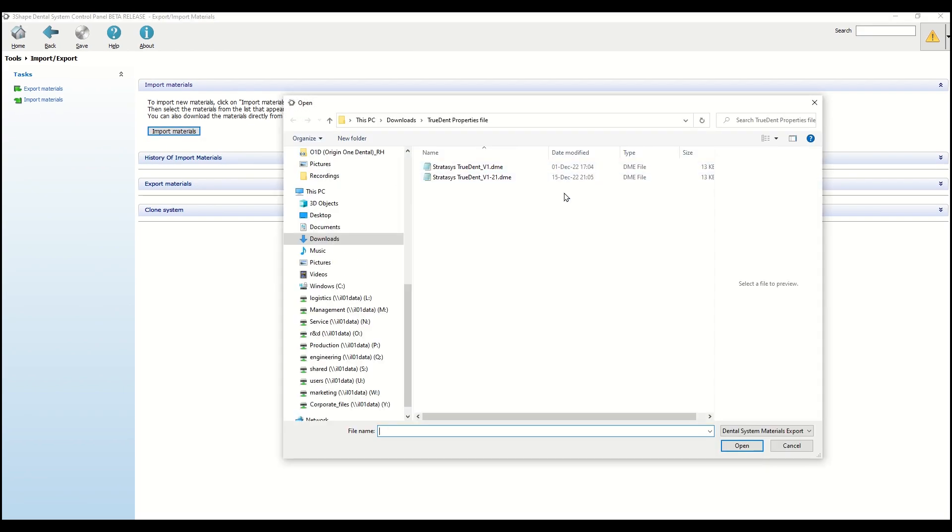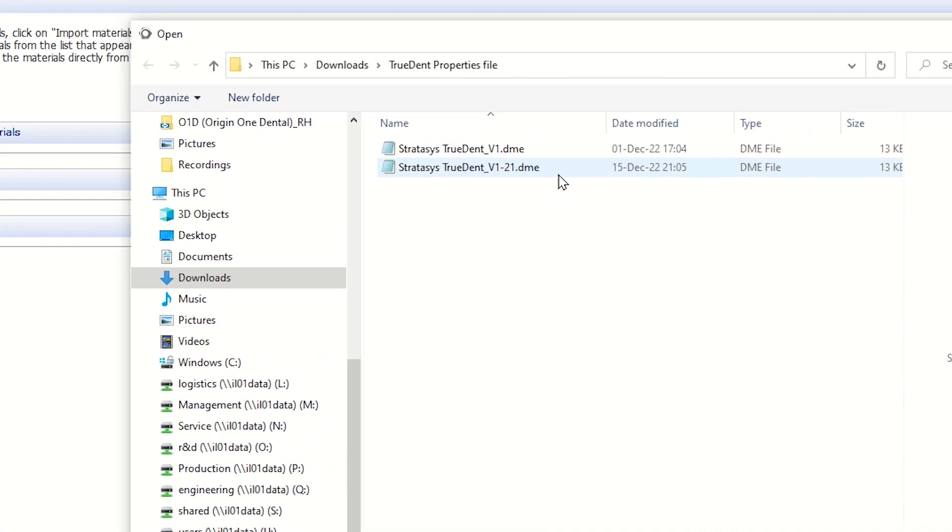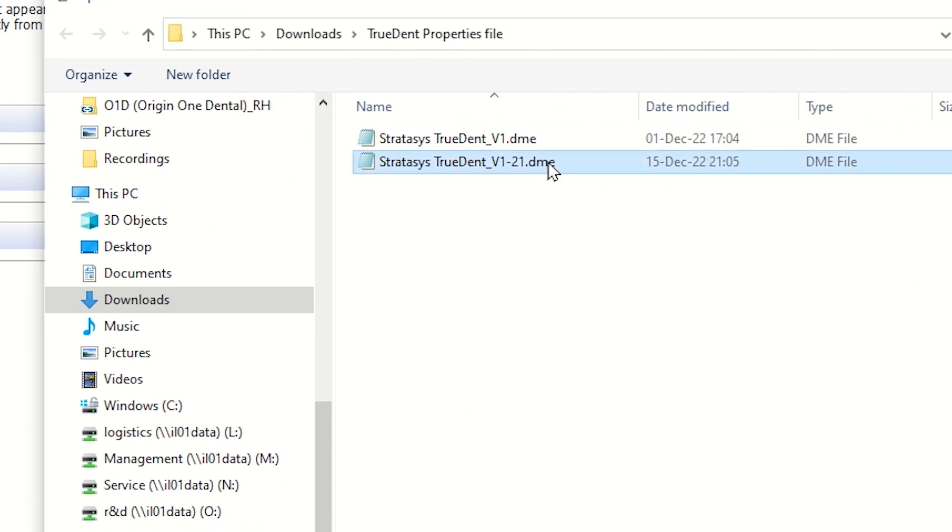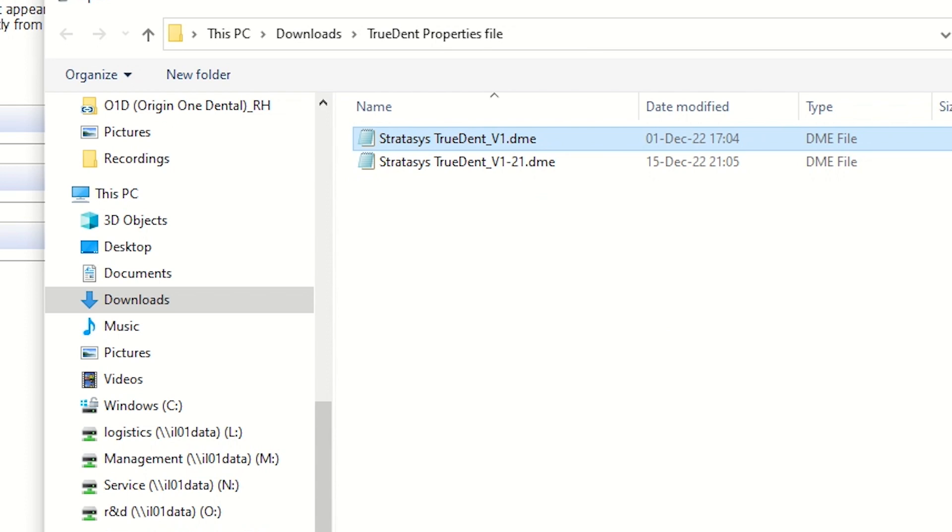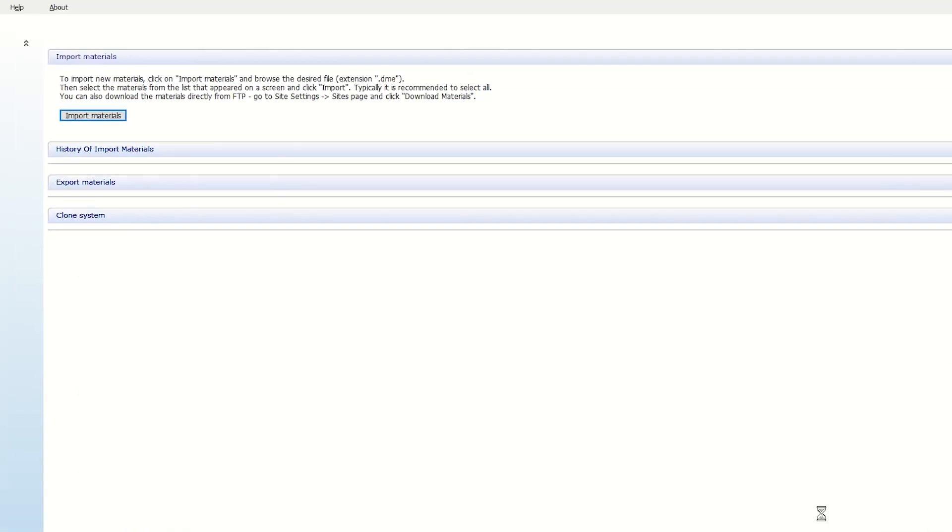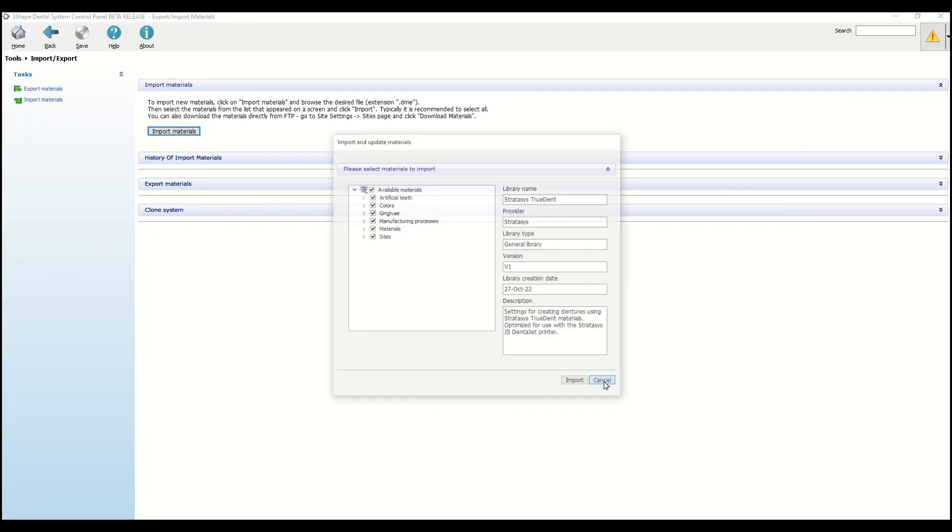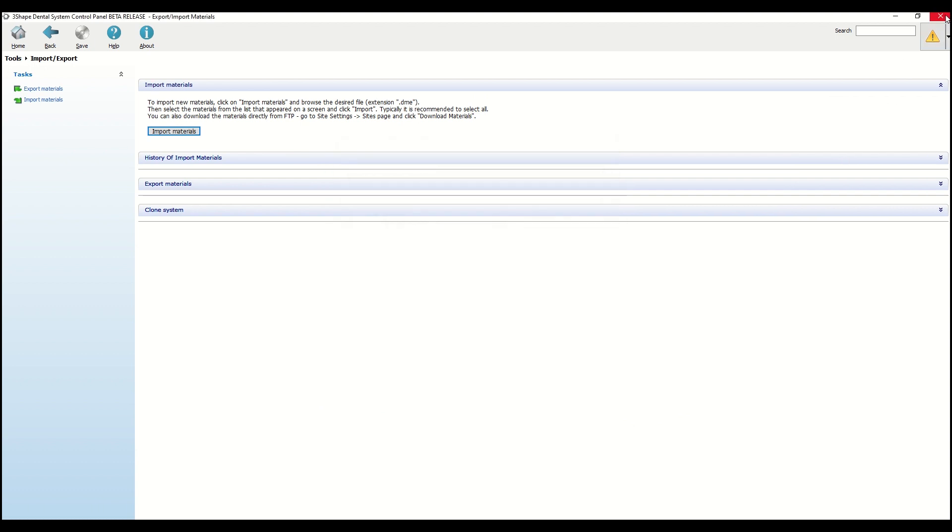Select the file relevant to you. If you're running 2021 version, select this file, and if you're running 2022 version and up, select this file. Open and import. When you're done, save and close.